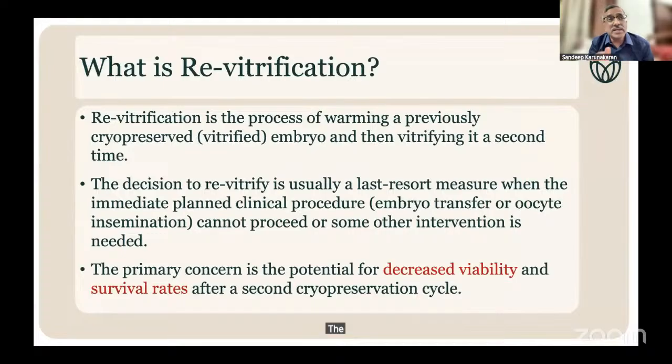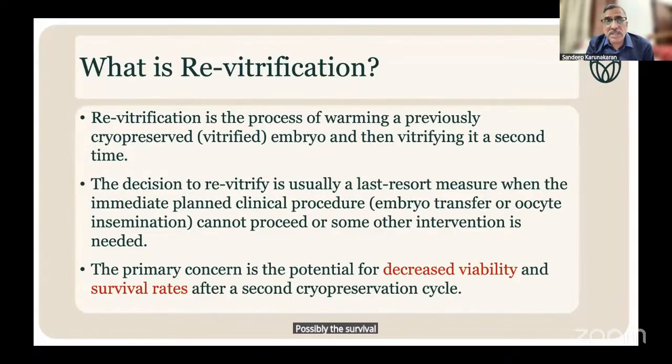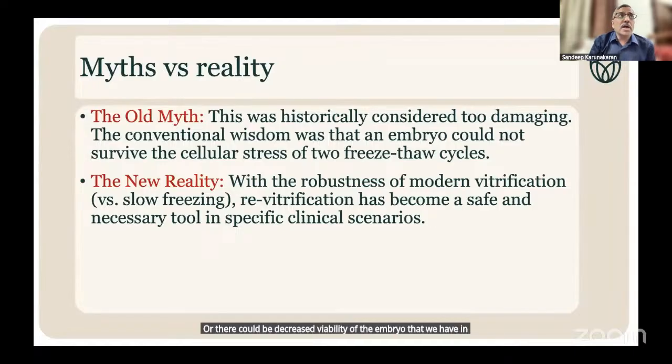The primary concerns earlier, at least definitely in the last decade or so, was possibly the survival rate wouldn't be as much as one would have with the fresh vitrification, or there could be decreased viability of the embryo that we have in our hand. So that is the reason why historically revitrification never actually saw the light of day.